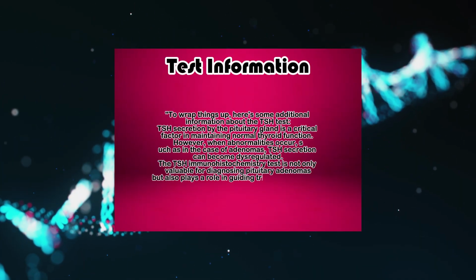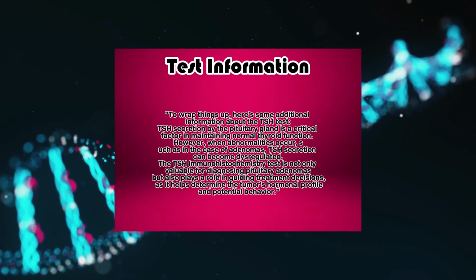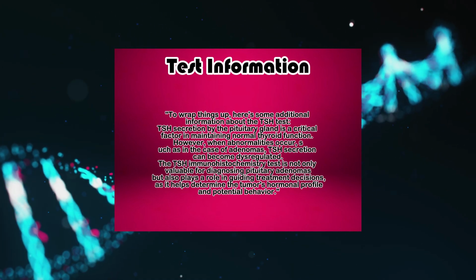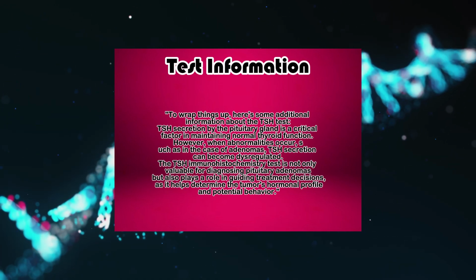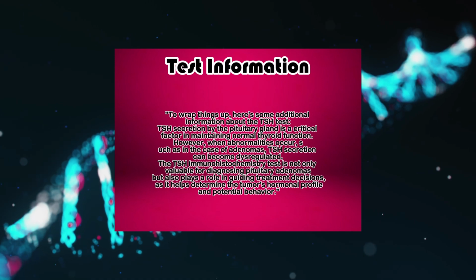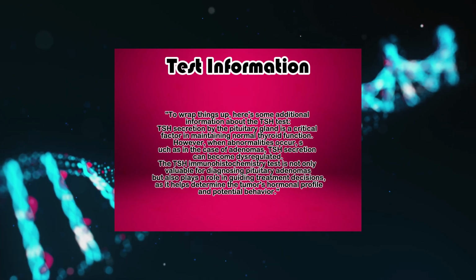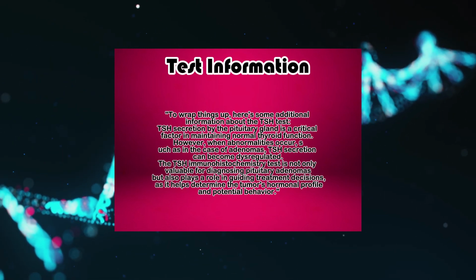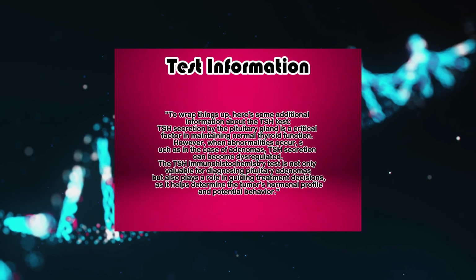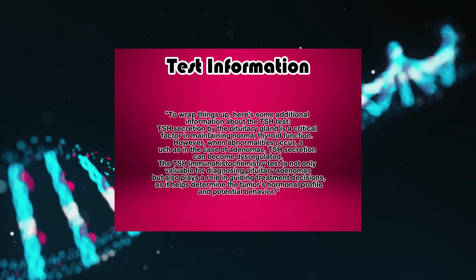Additional test information. To wrap things up, here's some additional information about the TSH test. TSH secretion by the pituitary gland is a critical factor in maintaining normal thyroid function. However, when abnormalities occur, such as in the case of adenomas, TSH secretion can become dysregulated. The TSH immunohistochemistry test is not only valuable for diagnosing pituitary adenomas, but also plays a role in guiding treatment decisions, as it helps determine the tumor's hormonal profile and potential behavior.